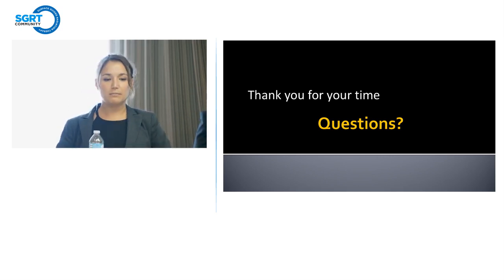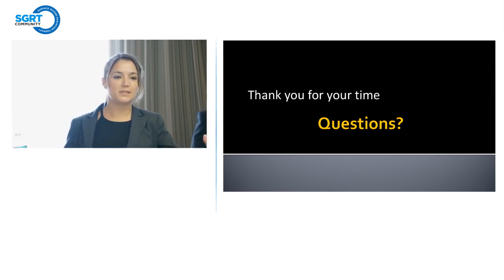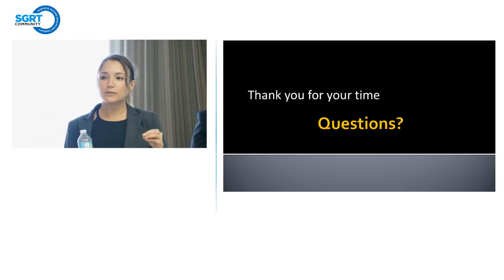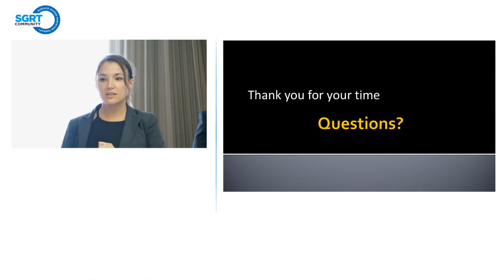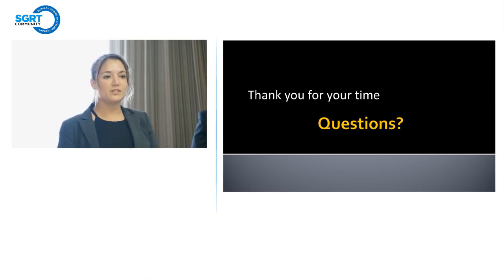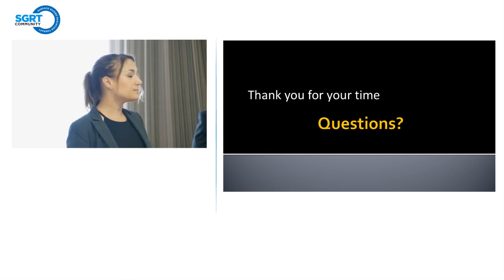So I think one of the things that's really helpful is, even though it might seem like you're just making your treatment setup time longer, just try to introduce it little by little and let people see how setting up to the surface will be more efficient and more reliable rather than just doing the 3-point marks. So just be patient and let people see the results for themselves, because that helps a lot in implementing the system, any system really.